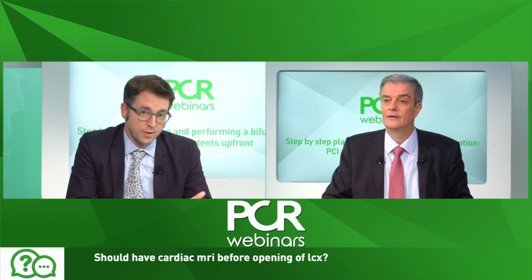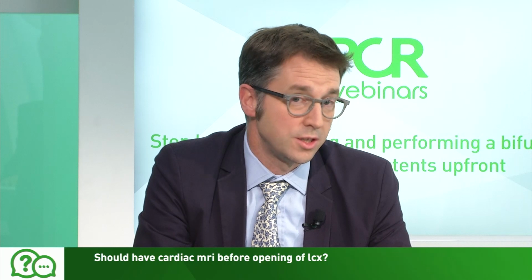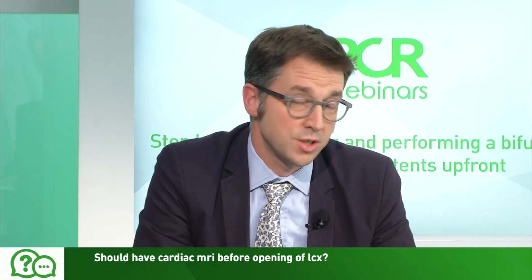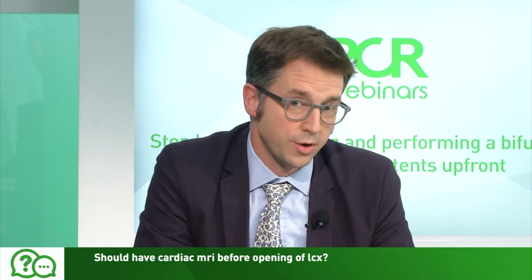Yeah, so a couple of comments. I think in terms of the learning and starting, there shouldn't be any fear of asking a colleague to join you, and having someone with you and sharing the experience and having someone that can also assist you in the decision making and take some of the heat off the pressure of what can be a challenging procedure, I think is really valuable. And these are cases that if you can run by dual operator is a luxury, but one that's very useful.